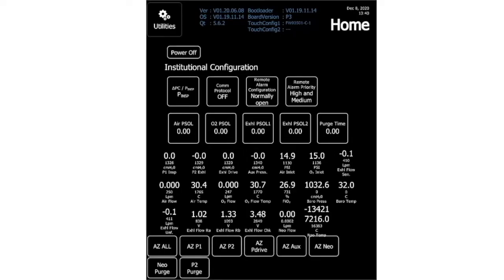First, I'd like to highlight a few things on the home screen of the service menu. What we're going to do is utilize my PSOL control buttons. These are the second row of my squares. My top row of squares are my institutional configuration settings. And below my PSOL configuration buttons is my monitoring area. And I want to look at a couple of measured values: one is my airflow, and then my P1 and P2 values.